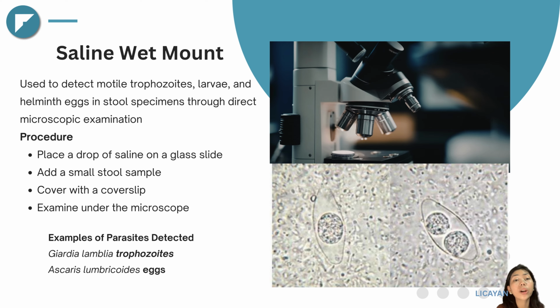Commonly detected organisms in here would include our Entamoeba histolytica trophozoites, the Giardia lamblia trophozoites as well, and the eggs of Ascaris lumbricoides.